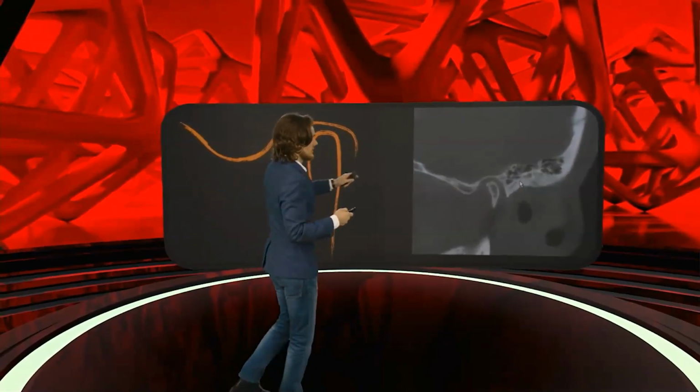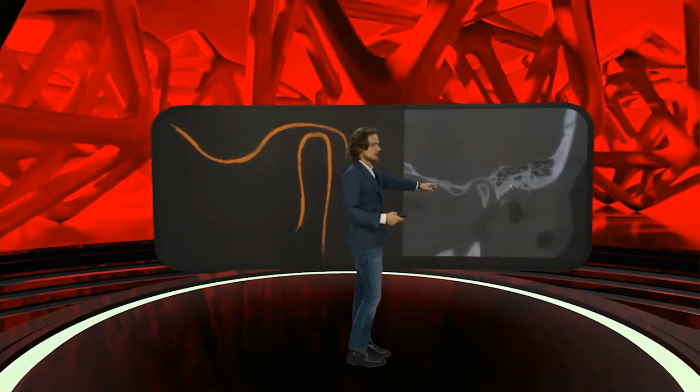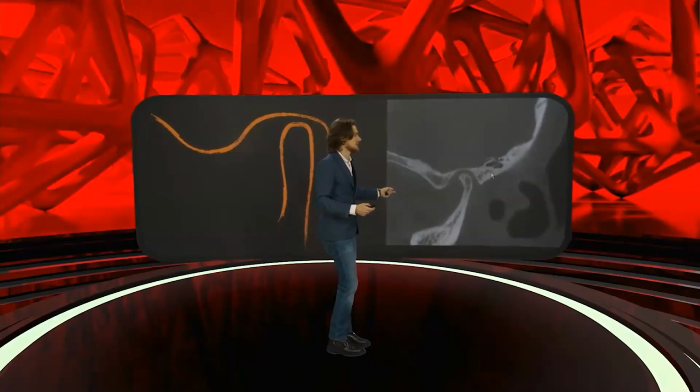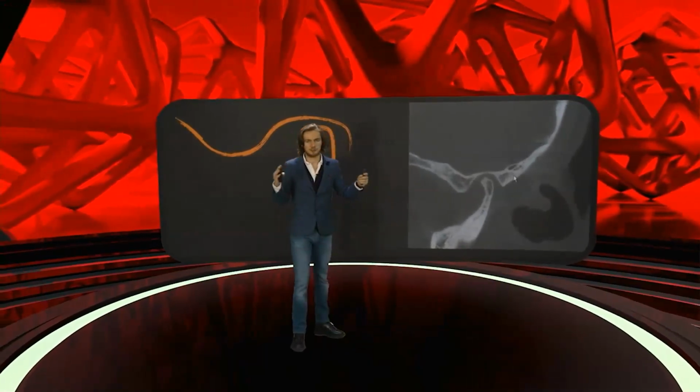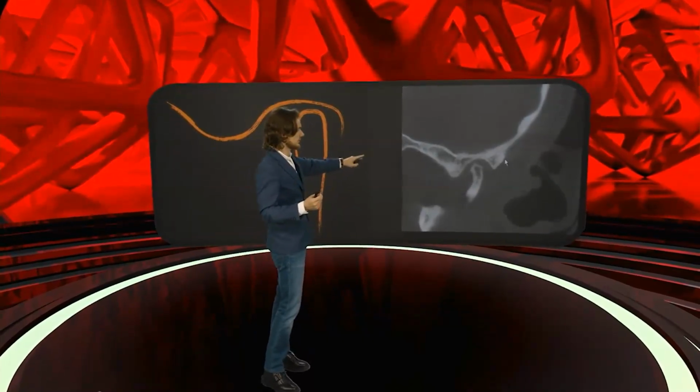Also, you will not see beautiful condyles for every single patient. In here, you can see that there is a very, very little condyle, and you could think that maybe this is a child. But if it is a child, it's fine, because the eminence normally is not fully developed by the age of 22, 23. But in here, this is definitely not a kid.